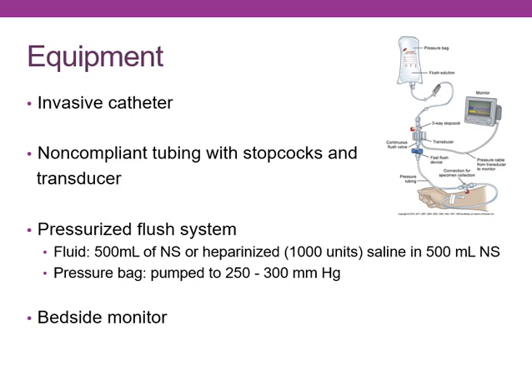Okay, so let's talk about the equipment that we need, because your healthcare provider is going to come in and say, "Hey, we're going to drop these lines, so can you get ready?" The first thing you need to do is get your line ready, primed, zeroed, ready to go, because if they are critically ill, we need to hook that up and have an accurate value as soon as we hook it into the patient. We don't need to take time to zero. So I want you to understand why we zero. That's the next slide. It's not so much how you zero. There is a video that I've got for you that you can look at the process of priming your tubing and things like that. That's what's important there. It's not exactly how to zero.